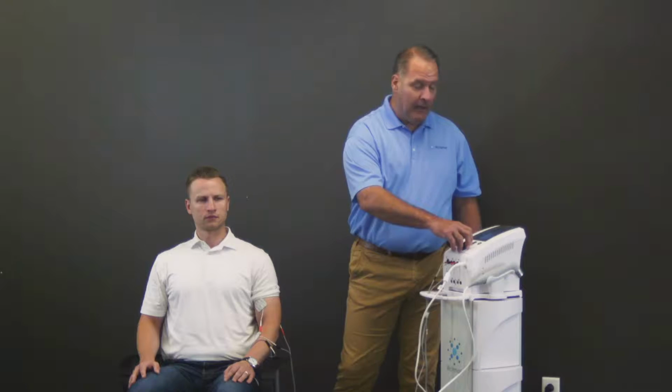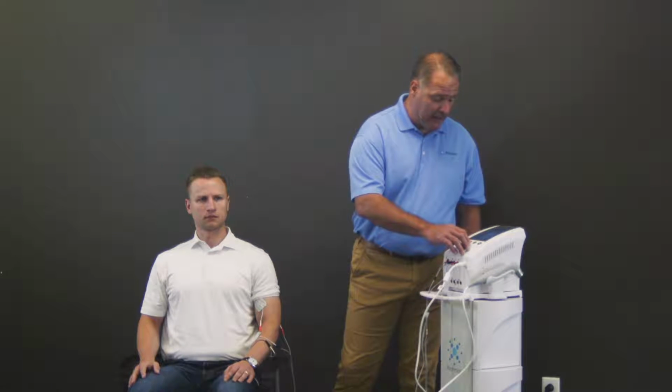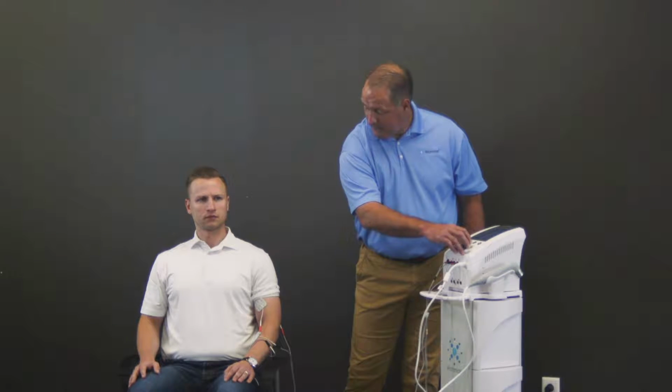What that means is that we change the carrier frequency to 10,000 hertz. It allows you to bombard the sensory motor fibers and actually create a nerve block. So you go into your carrier frequency and make a quick adjustment to the highest setting you can. Preferably you want to be at 10,000 hertz because that was what the protocol used. And then turn that up into a strong sensory feel. Do you feel it? Okay, when the patient gets to that strong sensory, you don't want it to go to motor.